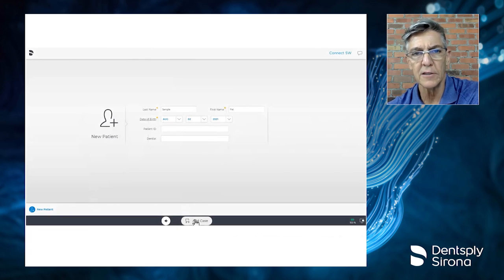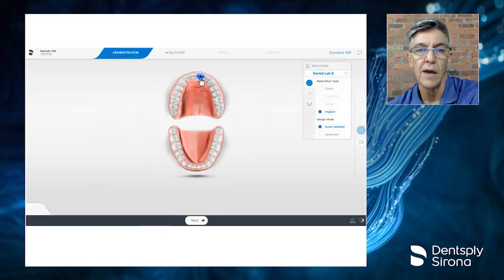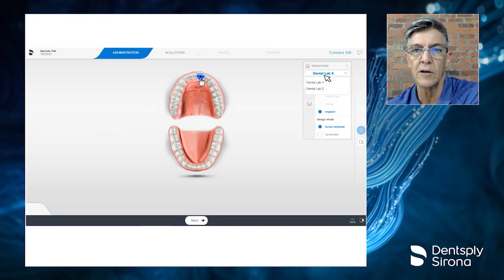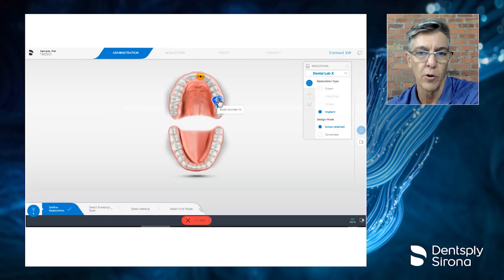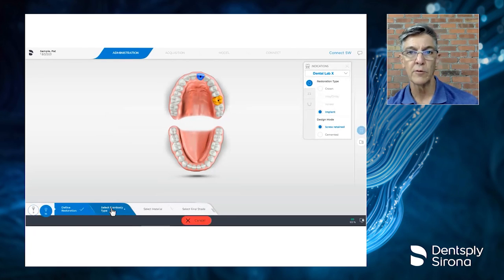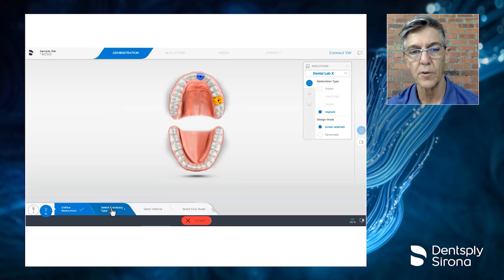So the process is pretty simple. We're going to work in Sirona Connect, and we're going to select where we want to have our restoration. In this case, we've chosen a central incisor and a molar. And we're going to choose our laboratory and who is going to receive this information.